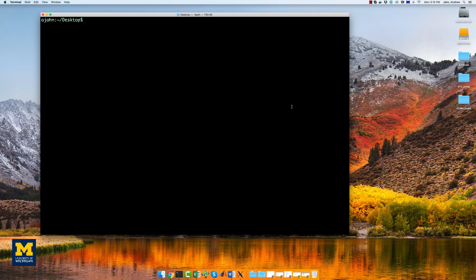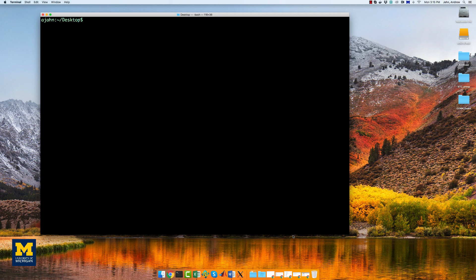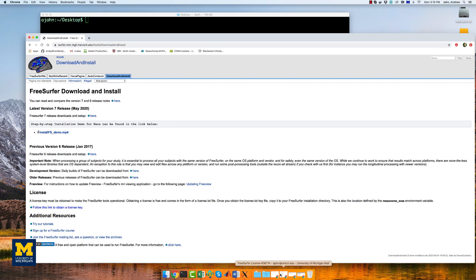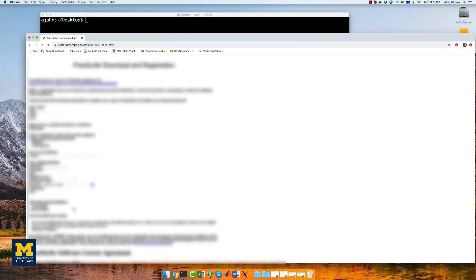If you haven't already installed FreeSurfer from a previous tutorial, go to this webpage that I'm opening up right now. As you'll see later, you don't actually need to download the entire software package. You just need the license.txt file, which you can get by filling out this form.